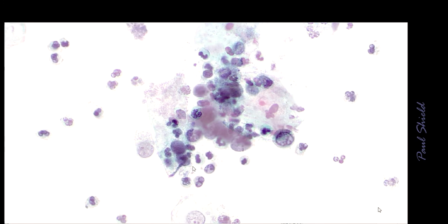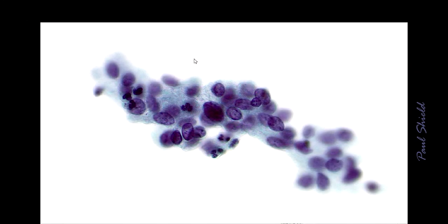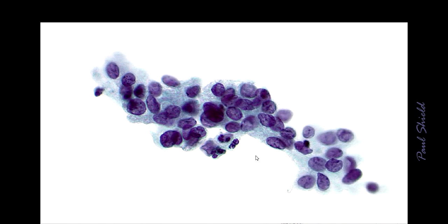Intermediate cell, debris, neutrophils, and here are, again, high-grade SIL cells. So notice how little cytoplasm they have, very high NC ratio, quite irregularly shaped. That one down there has quite coarse chromatin. This is a little loose group of them, and if I focus up and down, you can see there's quite a lot of variation in size and shape. That's always very helpful. They're very hyperchromatic, and not many of them are nice and perfectly round.